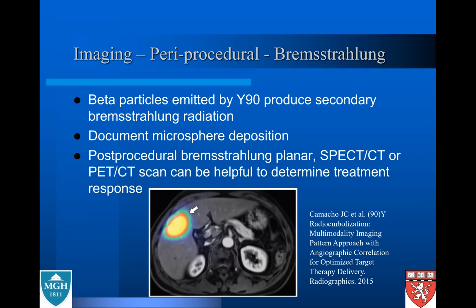And so where we've been limited is how well we're actually radiating these tumors and getting dose maps, which radiation oncology is very good at doing, where they can circle and say, this is how many gray this area got. We haven't gotten there. That's where we're heading now, because by doing PET CTs or SPECT CTs after our Y-90 injection, we can then get dose maps off of that. And then we know what radiation these tumors have gotten, an area of growth. And then lastly, you've treated the patient, they've gone home.